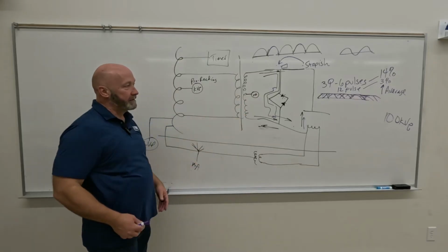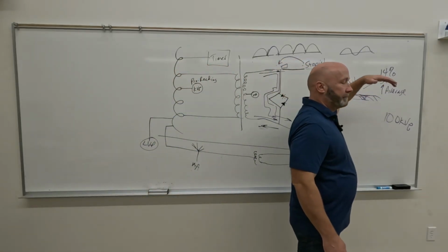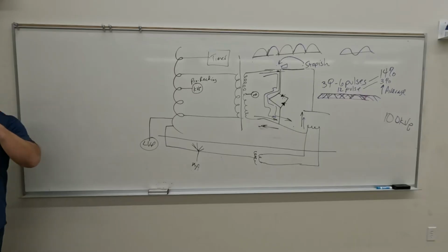We've got technology and we can create a much more efficient, high average X-ray beam, and the circuitry has shrunk to nothing. It's tiny. Okay, so any questions on those?